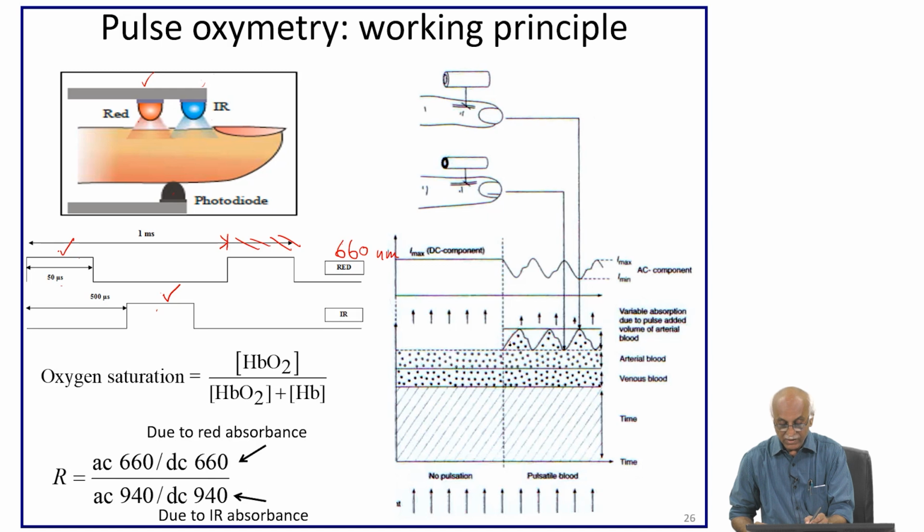So we will see, corresponding to the pulse volume of blood supplied by the heart, the corresponding signal at each point within this pulse.